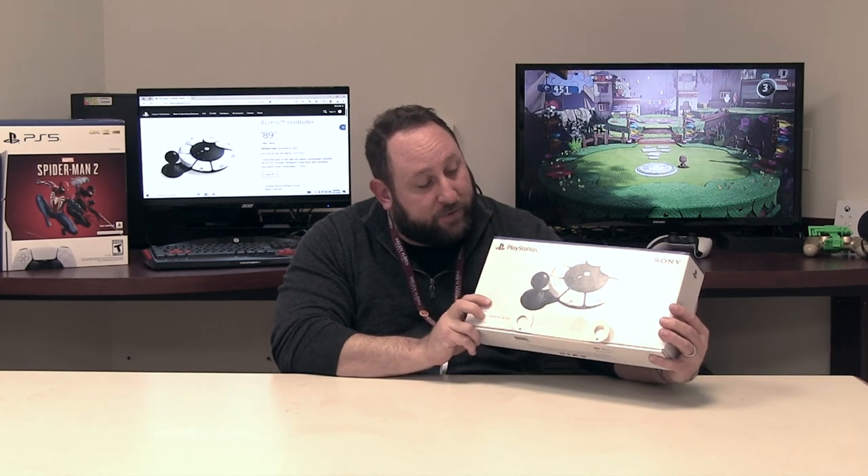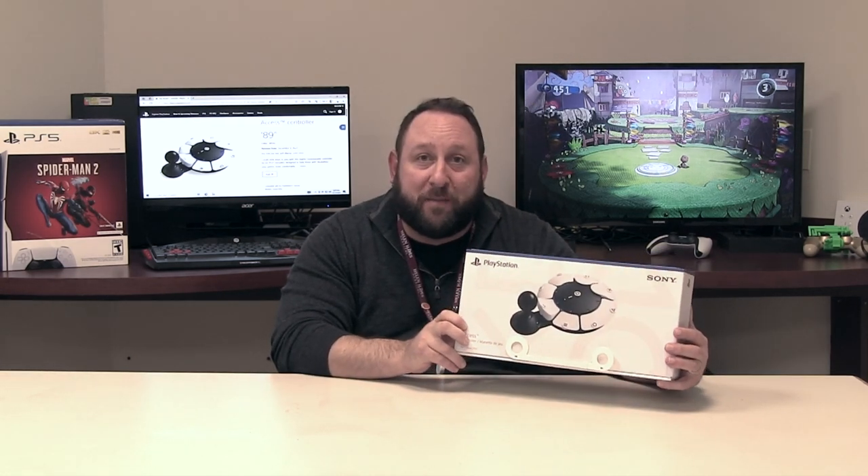Hello everyone, I'm Peter Gagliardo at Helen Hayes Hospital. I'm the Adaptive Supports Coordinator. I have here the PlayStation Access Controller, which came out last week. A generous grant from the Craig Nielsen Foundation allowed us to get our hands on this and get people back into gaming.